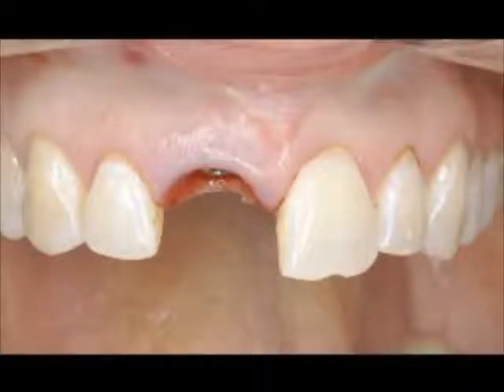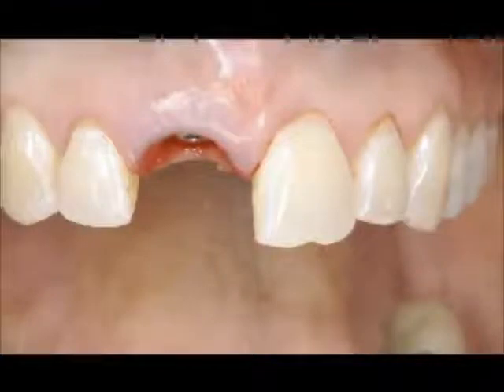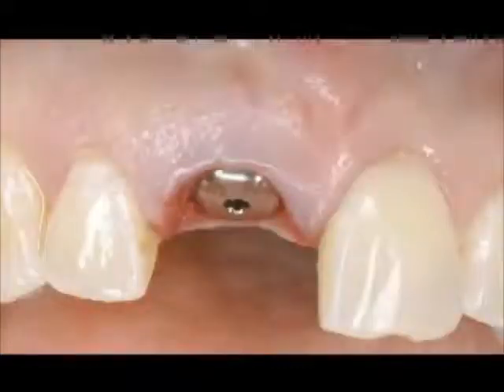This is something we've been doing for quite some time. Many of you out there use this procedure quite readily, just placing a healing abutment. The only problem with a healing abutment is its shape is conical and flat. It does not follow the natural scallop of the gingiva.